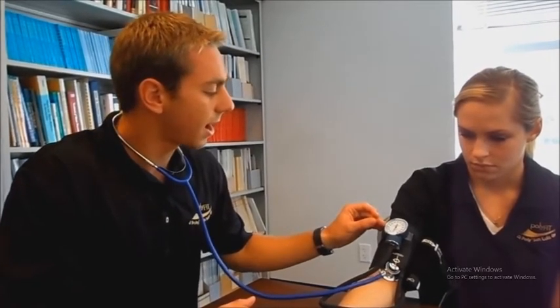And what you're hearing here is the first thump, which is their systolic pressure. That's when the heart has contracted and that's their highest pressure. You'll continue to hear light thumps, and the last thump you hear is the second number you record, and that's their diastolic pressure. That's when the heart is relaxed and it's refilling with blood.